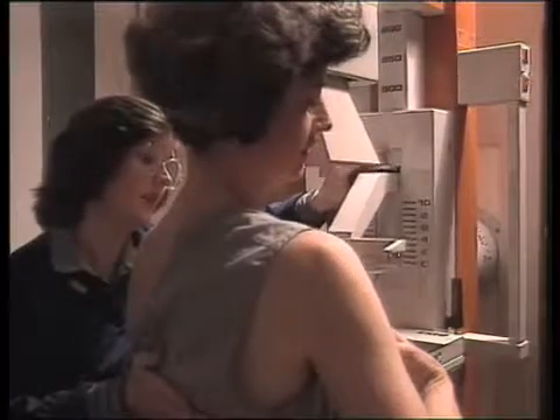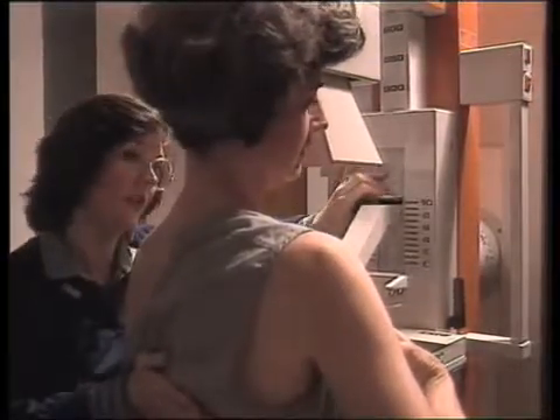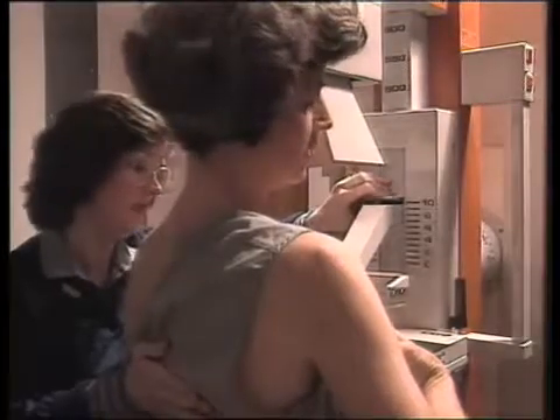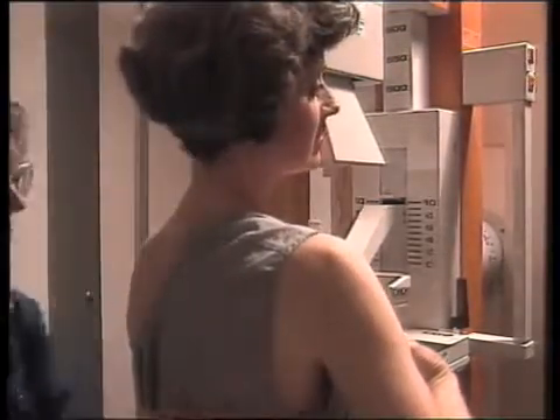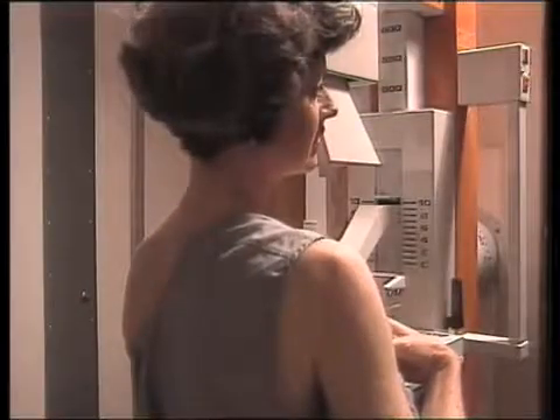This paddle's going to come down again for compression — remember, that's very important. Okay, real snug on you. Does that hurt? No, that's okay. Well, very still for me. Try not to move or breathe. Okay, hold your breath now.